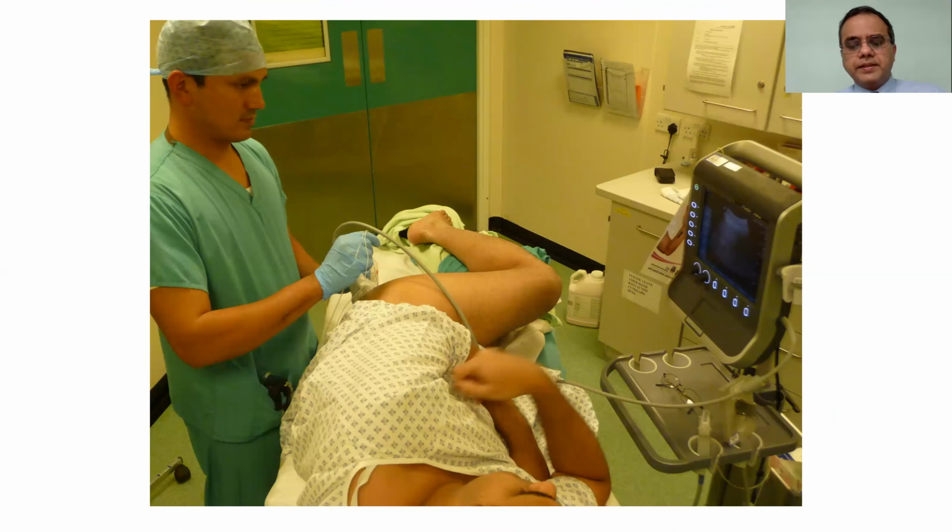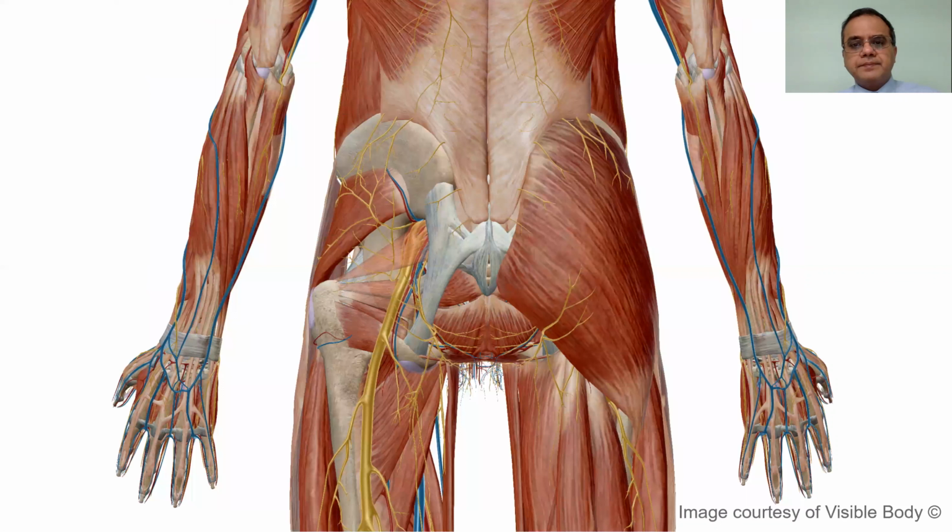So to do it, the patient lies on their side with the side to be blocked on top. The anesthetist stands behind the patient. The machine is in the front of the patient. Needle is introduced in plane. So everything is now in line, so no twisting and turning, and the anesthetist sees everything that's happening in front of him.